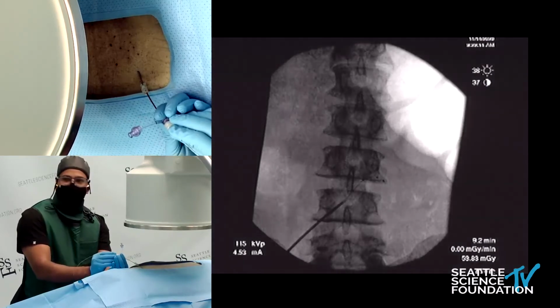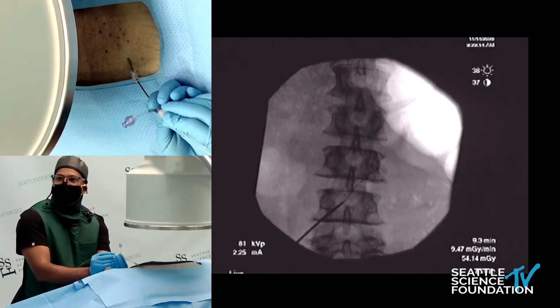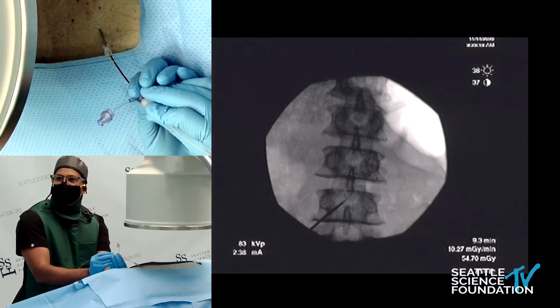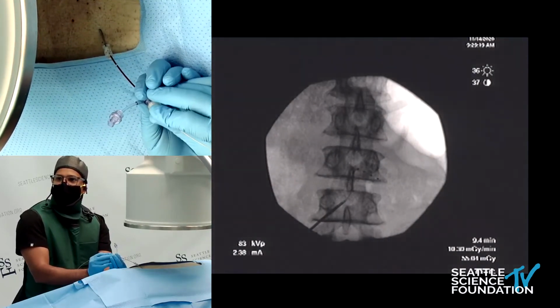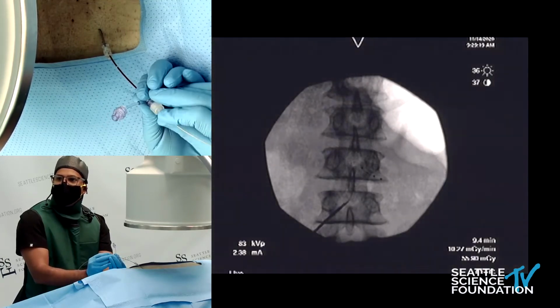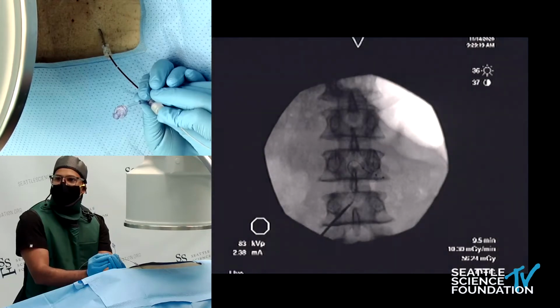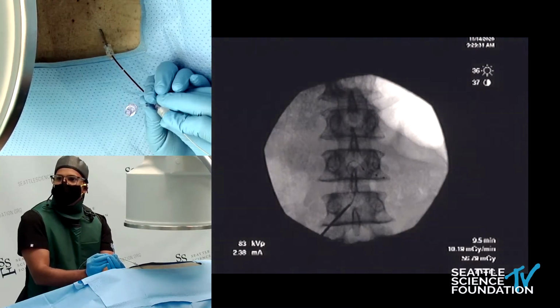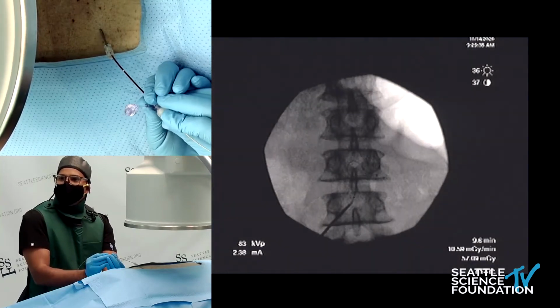And I'm going to pull back my sheath. And you can see the dot of the sheath coming back. I don't know how well you can see it. Whoops. All right, and I said whoops because I just pulled back a little bit. There we go. And you can see I'm feeding the lead, and it's heading cephalad here. Perfect. And I'm pulling back my sheath.